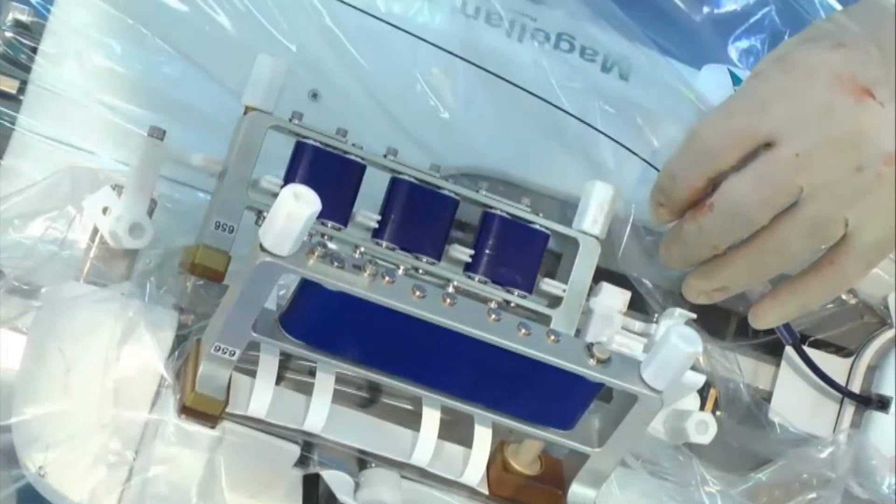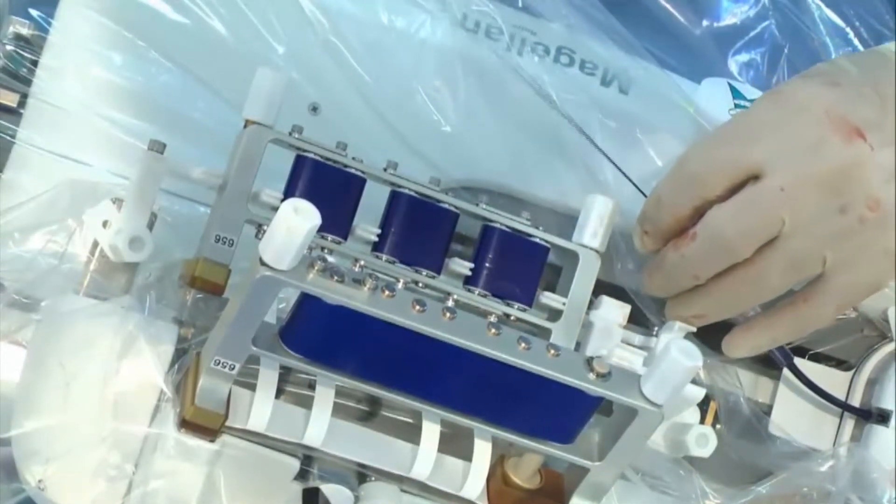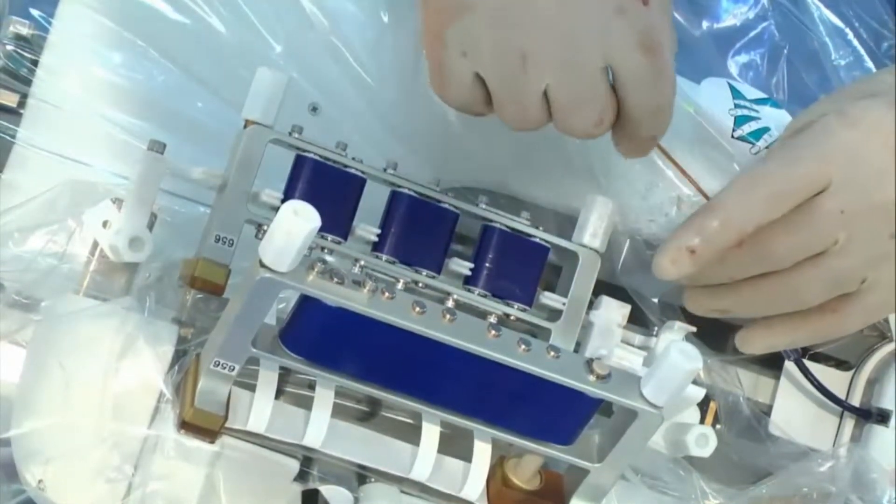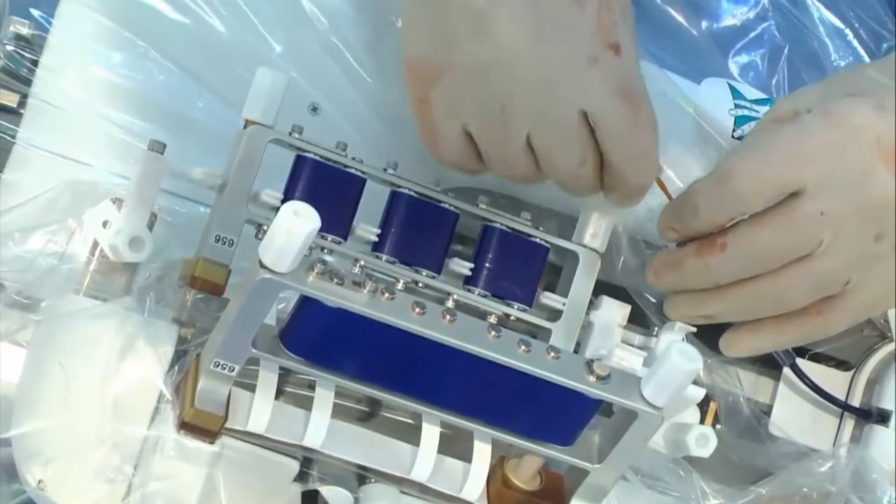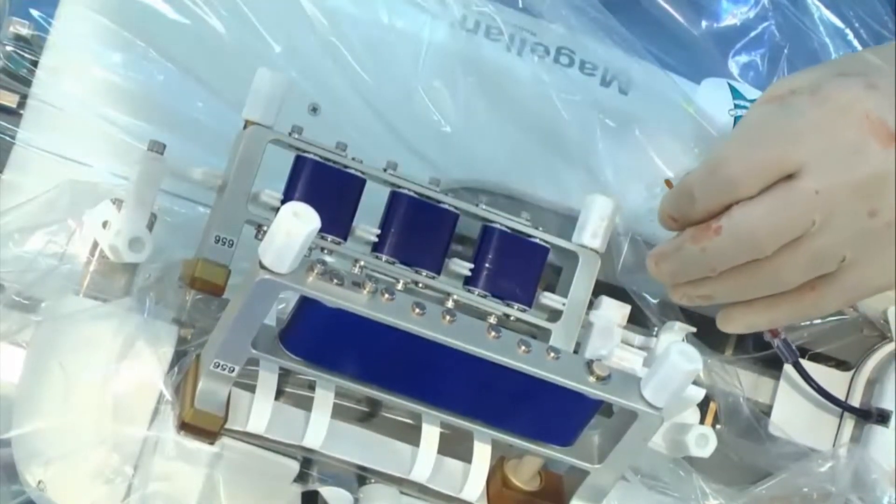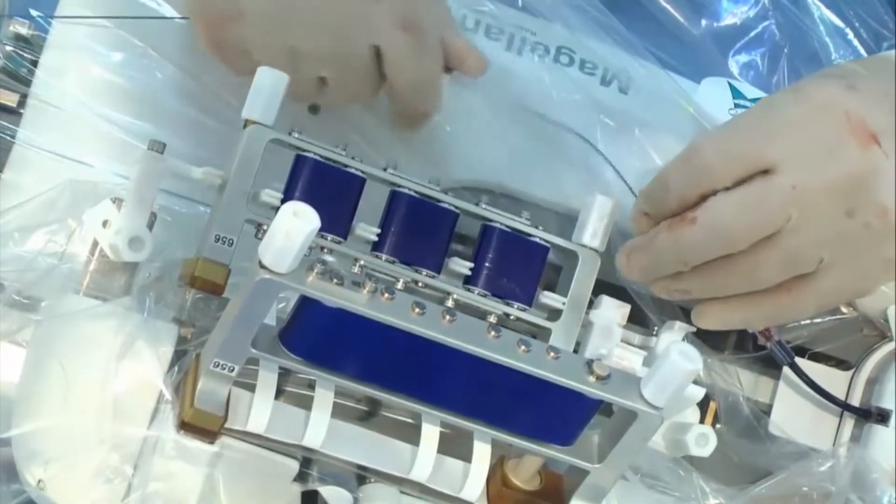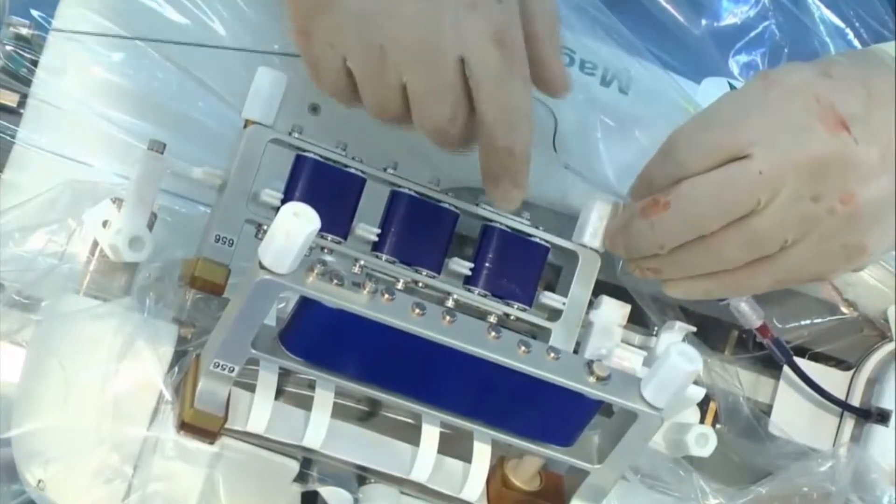What are your points, Marty, about control and ergonomics? Just from doing... when we operate on tibials, or if we do microsurgery, which I did in the lab for a while, there is no tactile feedback at all. It's all visual.